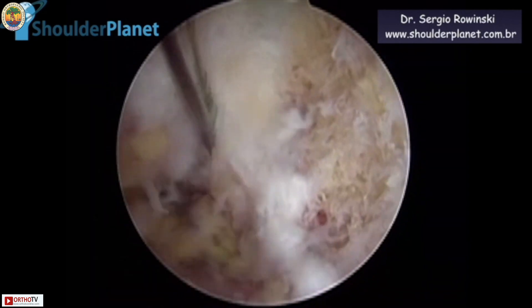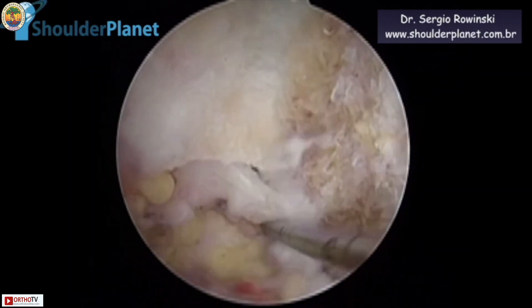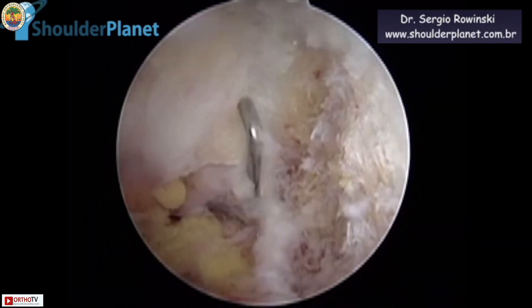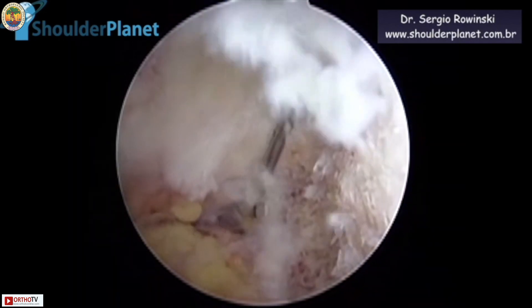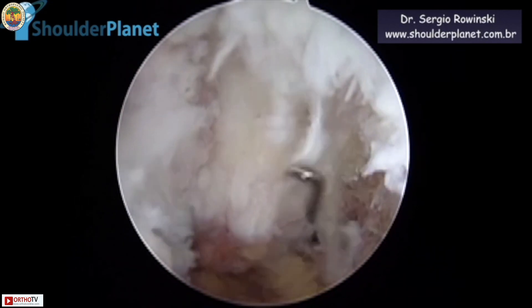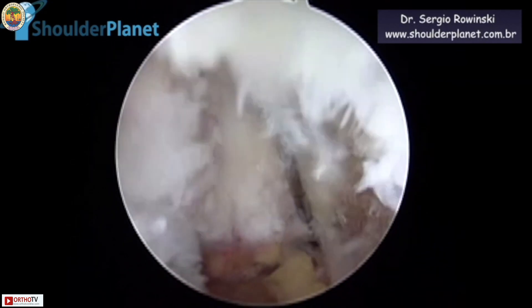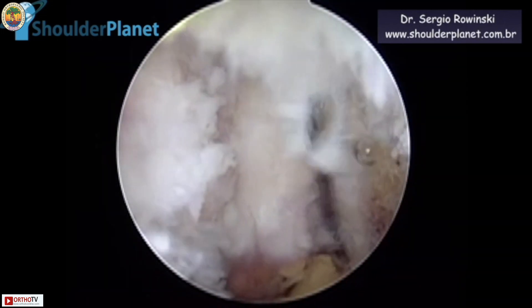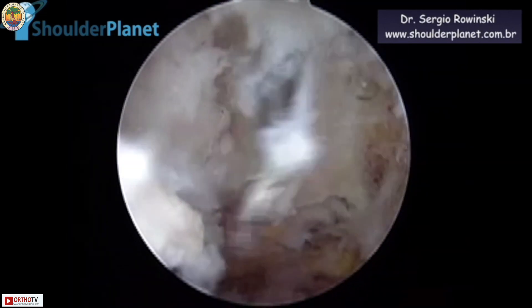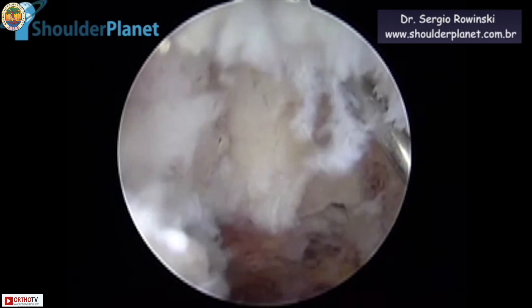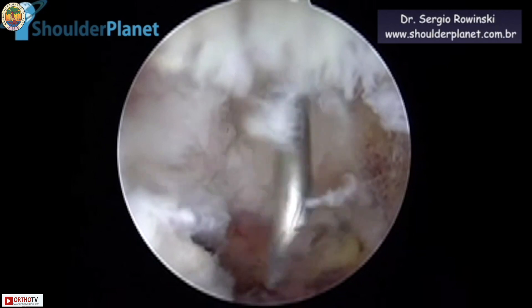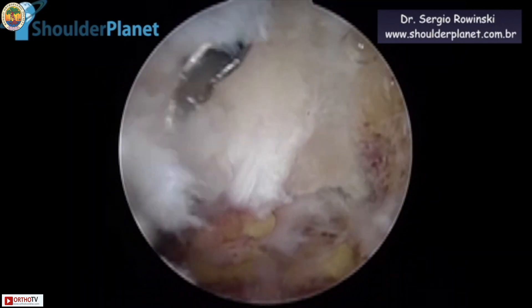We are palpating the AC superior ligament with an arthroscopic probe, just to be sure that no bone was left in the middle of the AC superior ligament. In this case it was absolutely fine. We are seeing the acromion on the left and the distal clavicle on the right. Now we are filling the interval with the spinal needle — the acromion on the left, the distal clavicle on the right — and we can clearly see that we had created quite a nice interval of about one centimeter. At that moment the surgery was finally finished.